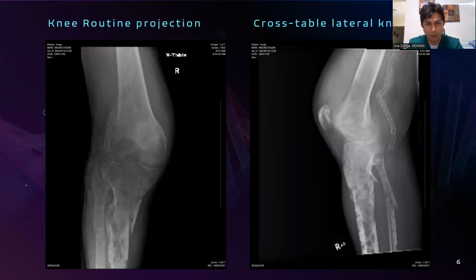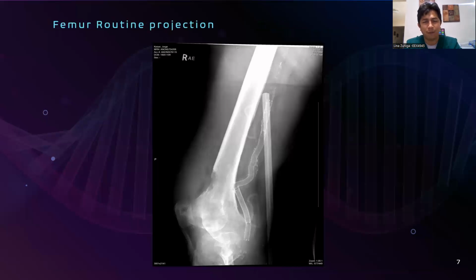The AP, as I said before, we already had the tube and the knee was already in position. We just basically showed that X-ray. Now the oblique was a little bit challenging as well, and took a little bit of thinking outside the box. What I mentioned to the tech was, why instead of obliquing the leg, we just oblique the CR, which was basically giving an angle to the CR to try to get the picture that we got. And this is what we actually got here for the knee. And then we went to the other extremities, again, the femur.